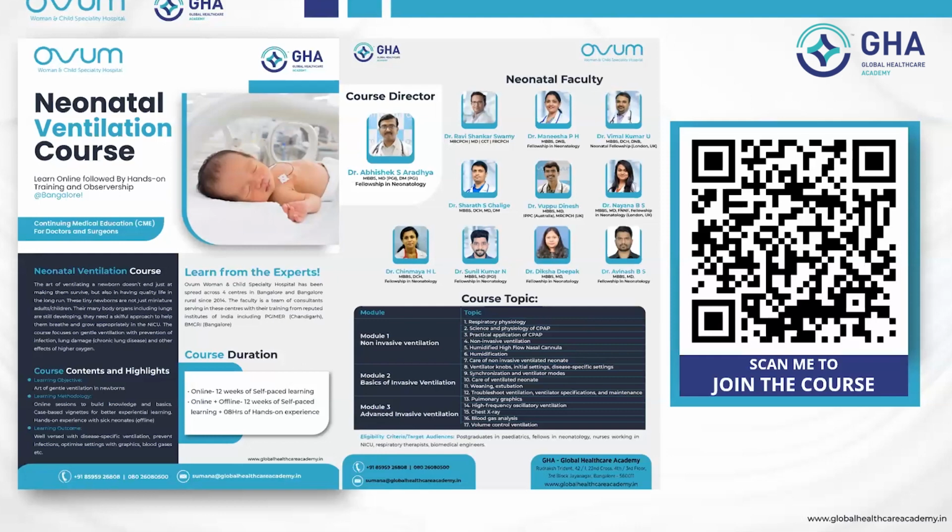The maximum, we use up to 7 or 8, but less than 28 weeks, maybe 8, 9 or 10 is also possible. But in the Western world, they go up to 10, 11, 12 also. But these are very small babies, like 25, 26-weekers, who tolerate slightly higher pressures because the lungs are stiff and alveoli are still not well formed. But in our units, which are 28 to 34 weeks, pressure somewhere between 5 and 8 is what most of us are comfortable with. And FiO2 up to 50% and not more than that.